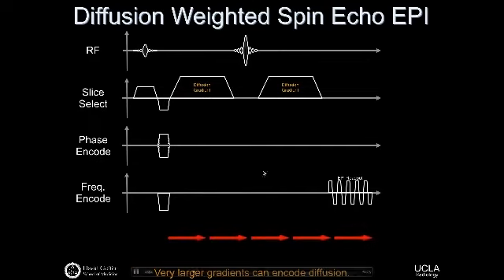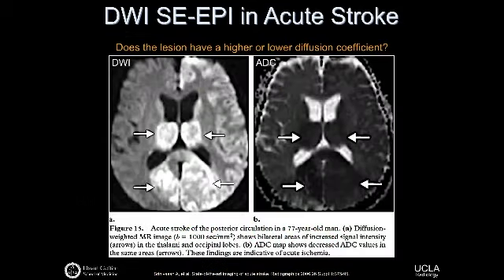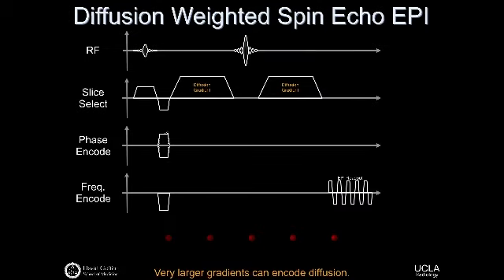This is a quick example of how diffusion-weighted imaging works. Before we get to the movie, let me walk you through the sequence. So here, it starts with the normal stuff, sort of the slice selection kinds of things. The difference here in this particular sequence is the addition of a really big gradient that we call a diffusion gradient. And the diffusion gradient happens before the 180, and we have to play the same gradient after the 180.